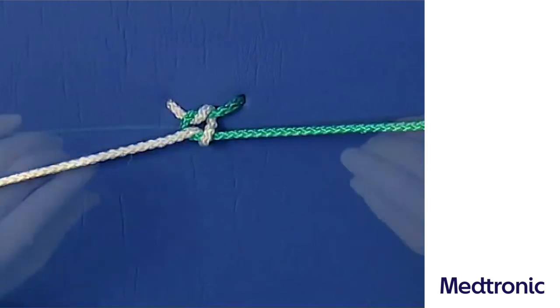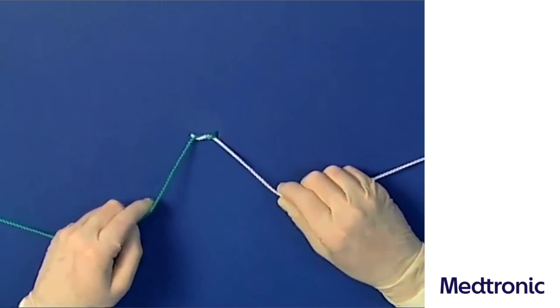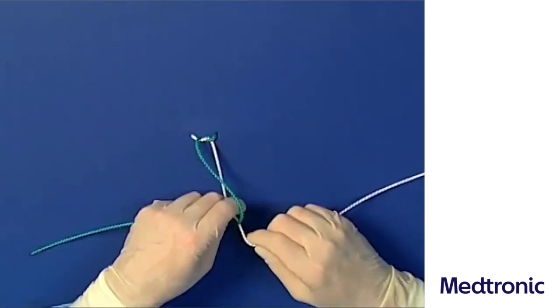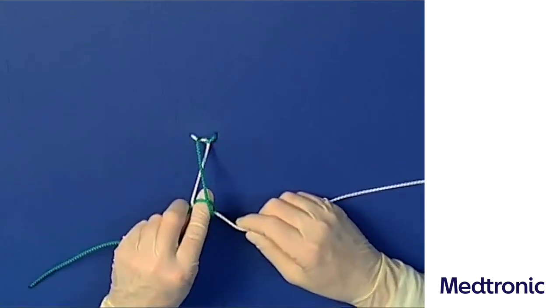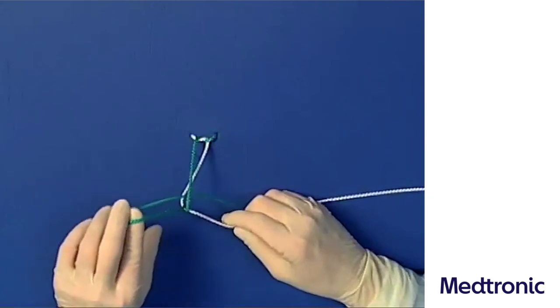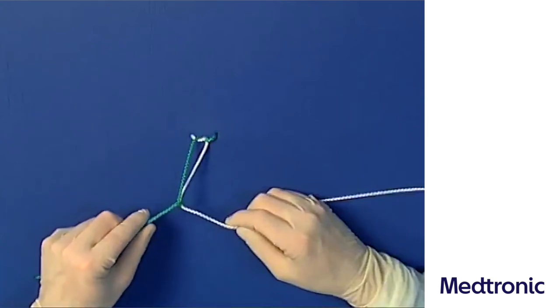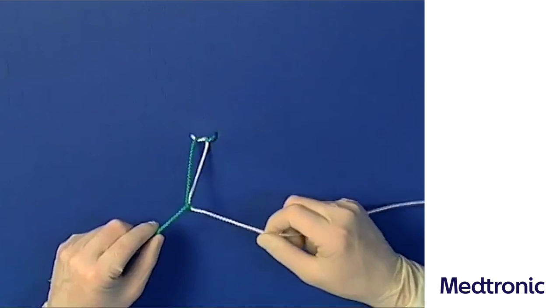Alternatively, the second loop can be produced by using the index finger of the left hand. It leads the tying thread over the pulling thread and then moves under the tying thread. The index finger pulls it upwards and thus forms the second loop. Again, the hands must be turned anti-clockwise to be able to lay the loops flat.